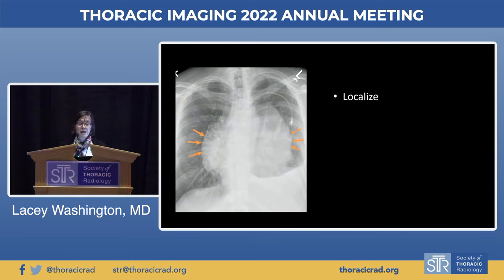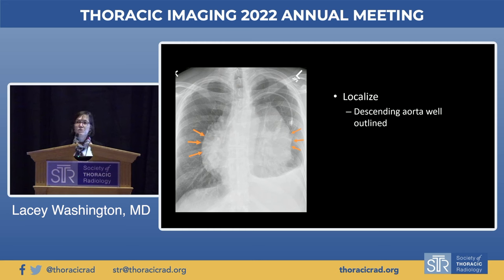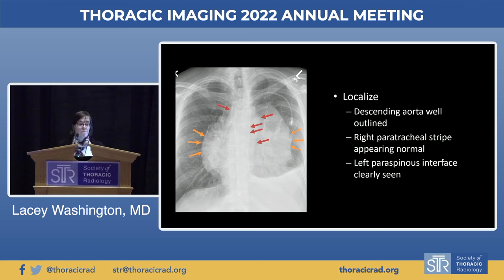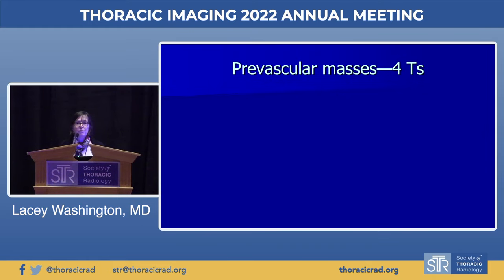We'll do this in a case-based format. Looking at this obviously abnormal chest radiograph — the anterior AP film — the first thing I notice is that the descending thoracic aorta is very well outlined and pretty normal in appearance. The right paratracheal stripe appears maybe a little abnormal but mostly not, nowhere near as abnormal as this big mediastinal mass. The left paraspinous interface is also seen pretty normally through the mass, suggesting it doesn't involve those structures. The heart border is not well seen, helping me localize this as a prevascular mass.